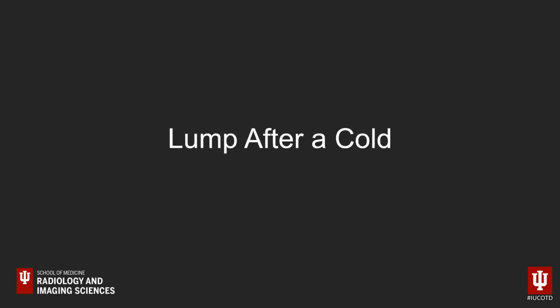Okay, so for this day's case of the day, the clinical history is lump after a cold. Patient started feeling a lump in their neck after they've had a cold.